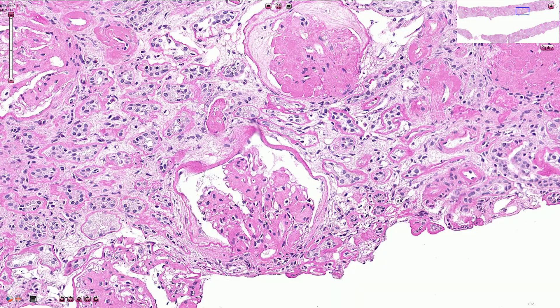Deposits of hyaline material can be found not only in the center of the glomerulus but also underneath the parietal cells of the Bowman's capsule, as seen here in this case.